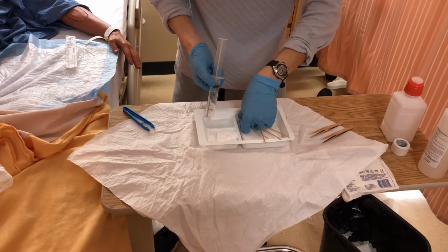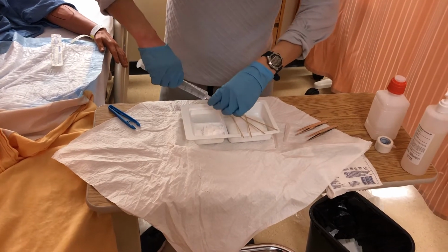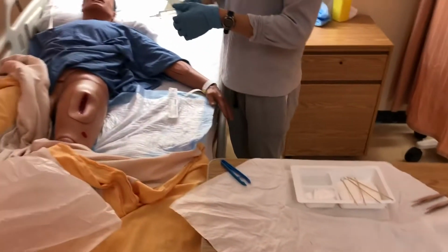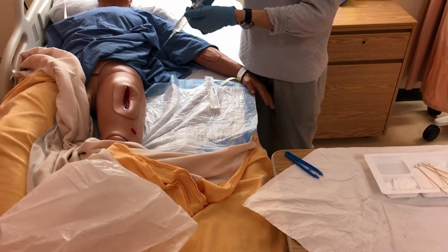After doing my assessment, I'm going to throw this out in the garbage. For demo purposes, I'm keeping it on the side. I'll get rid of my gloves. I'm going to stand from 5 centimeters away and irrigate the wound. Now I'm going to prep my supplies.